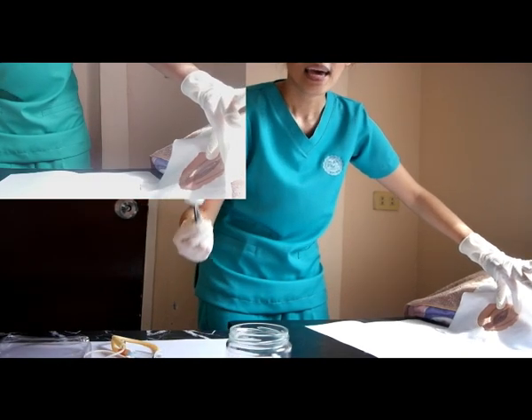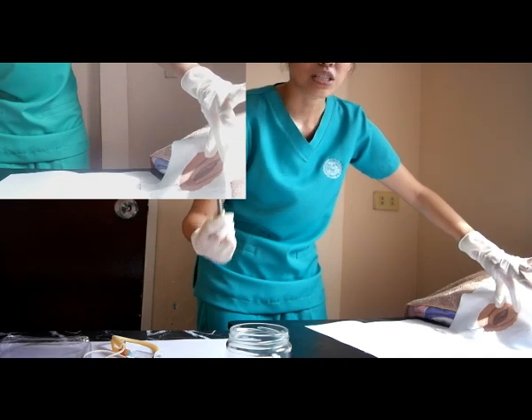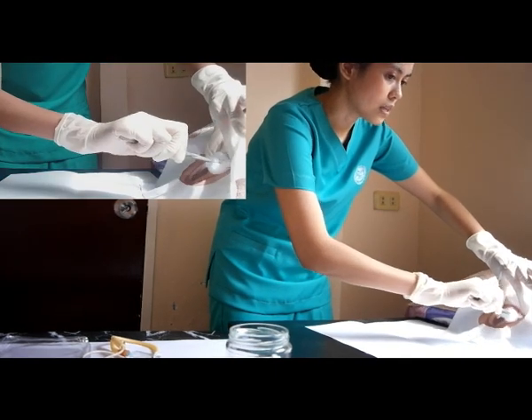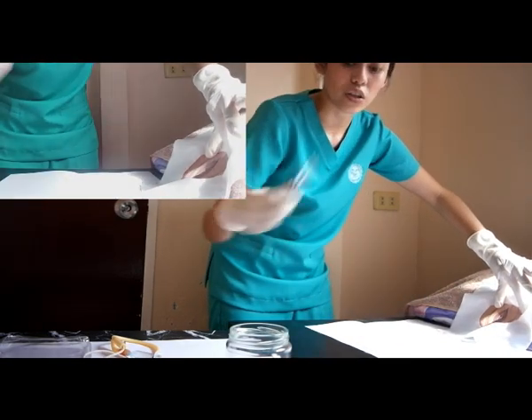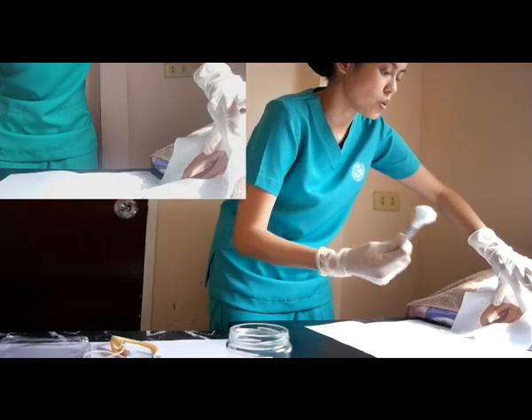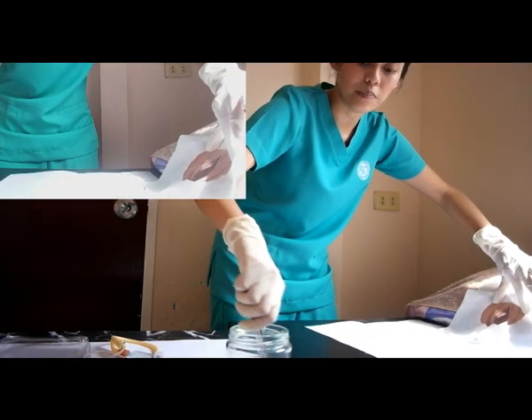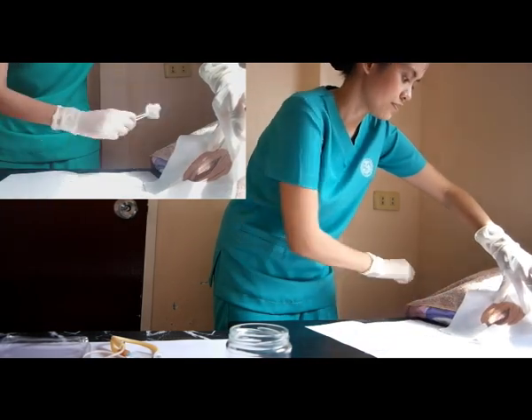So the technique in cleansing the meatus is from farthest to nearest in an antero-posterior direction. So first we're going to wipe the left side, which is farthest from me, top to bottom. And we're going to use another cotton ball. We will be using a cotton ball for each side. So nearest to me, which is the right side, top to bottom, and in the middle, top to bottom.